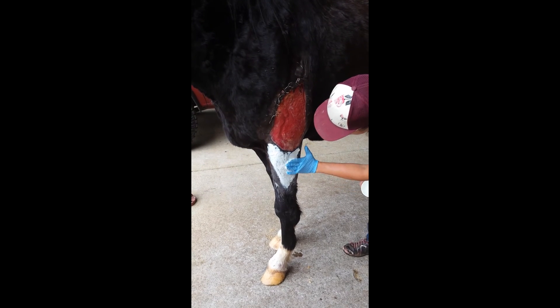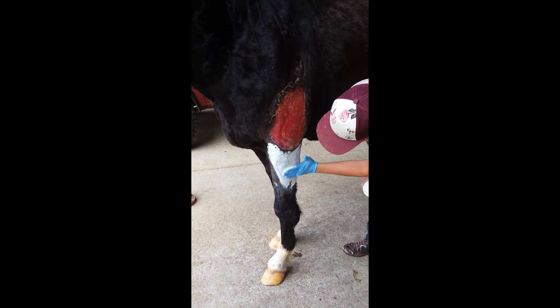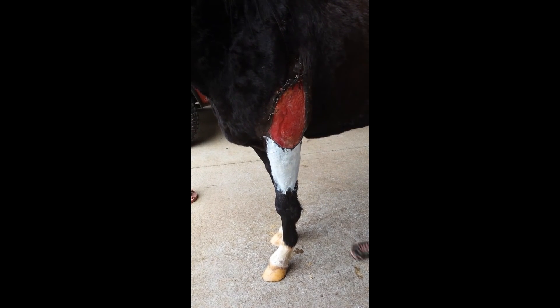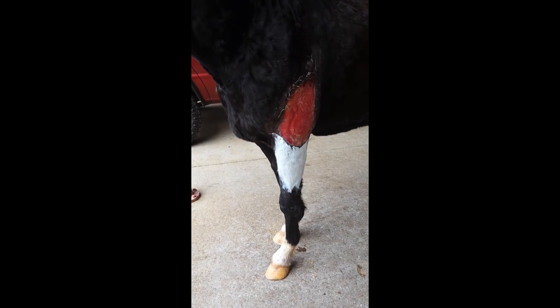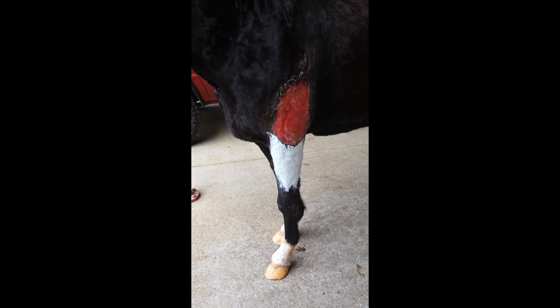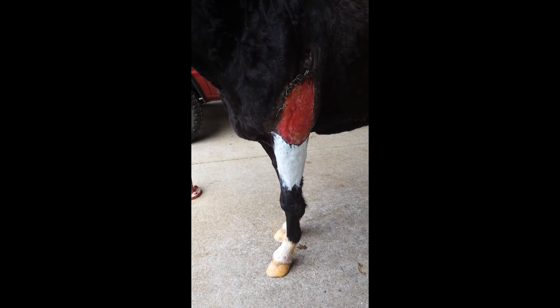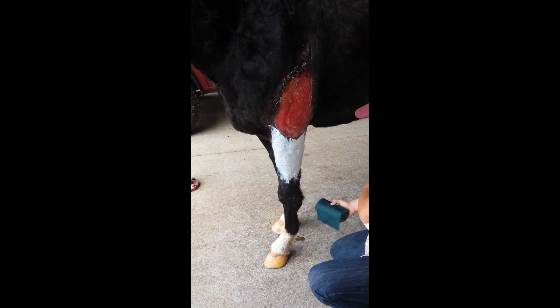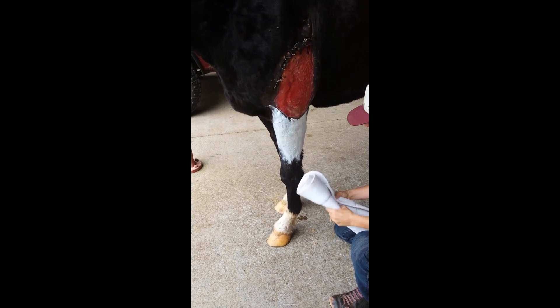This horse has a wound requiring extensive bandaging and stall rest, and as a result she's getting a lot of swelling and stocking up in her lower leg. So I'm wrapping her for two reasons: primarily to help with her circulation, and secondarily to help restrict the motion of her leg so that she is not moving around more in the stall than she should be, and putting more stress on the bandage. So we're going to start by bandaging her lower leg to try and help push the fluid back up into circulation.